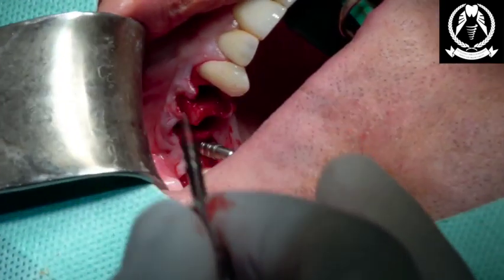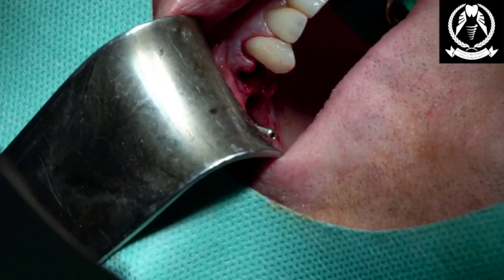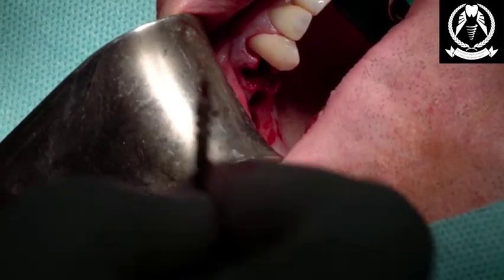Okay. Open wide. So what we're doing is just going to put some synthetic grafting, no membrane, over the whole area to support the tissues. And I also get an improvement of the biotype of gingiva. So when we get non-attached gingiva, actually the gingiva gets thicker. As well as developing actual bone with this material, it's resorbed completely by the body, it's synthetic, and there's no pigs in it, or cows.